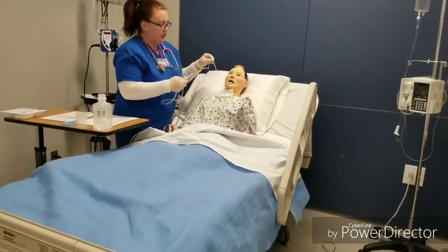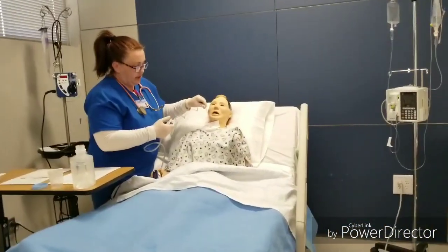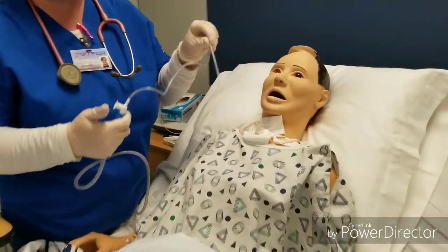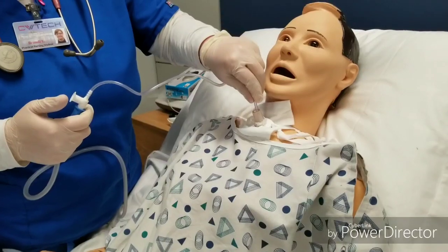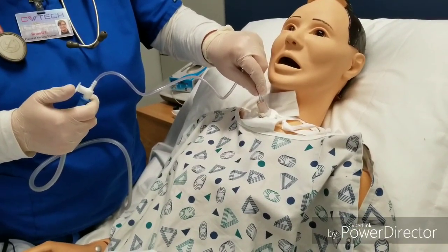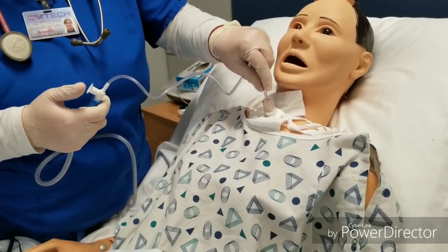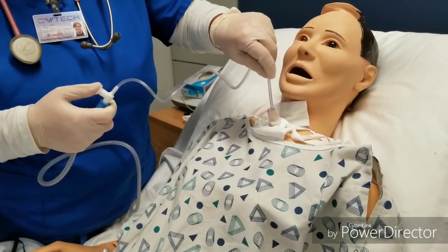For this, you are going to go in the trach. Do not apply suction while going in, only while going out. You go in, and you're not going to go in until you meet resistance, only the length of the trach. You don't want to enter the airway. You want to do the pill roll as you're coming out and intermittent suction.